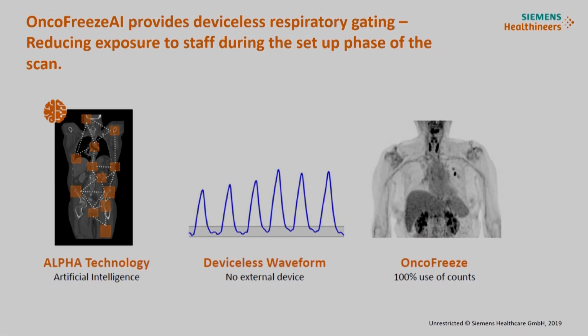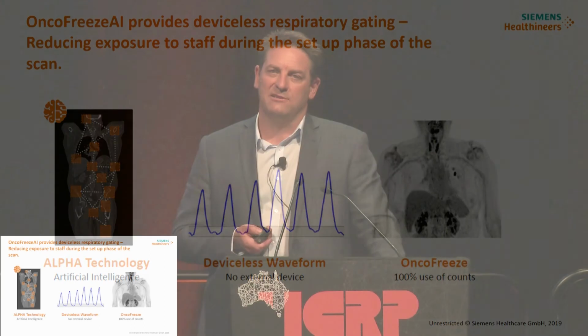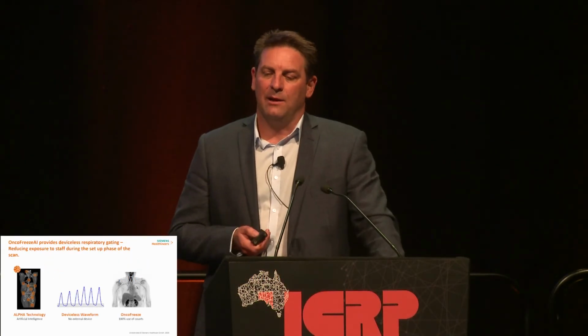So it does contribute to a reduction for staff dose. Another recent feature, this one was just released at the EANM meeting in Barcelona a few weeks ago from our perspective, but is also available from other vendors, deviceless gating.